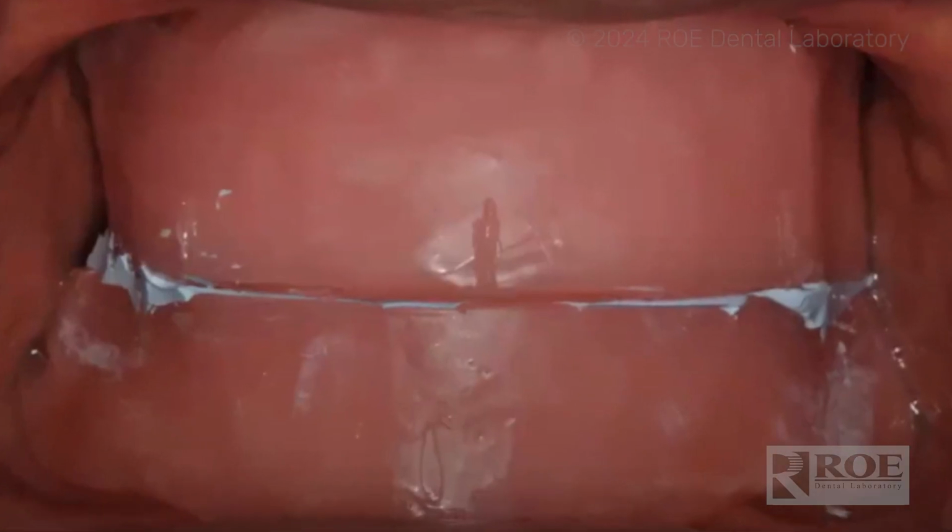If the patient is presenting from the stage of you are completing the bite block, we're going to want the bite block in place with the markings, midline, lip line, high smile line, cuspid line, along with the photos for the full face, full smile. These photos just help us incorporate it with our design process and are really beneficial to us at the lab.